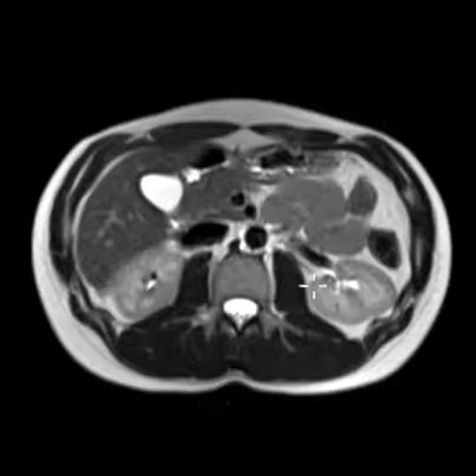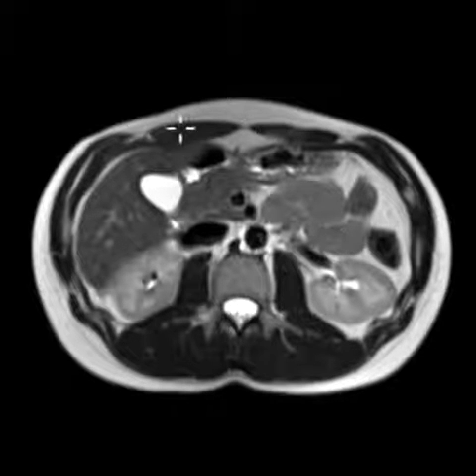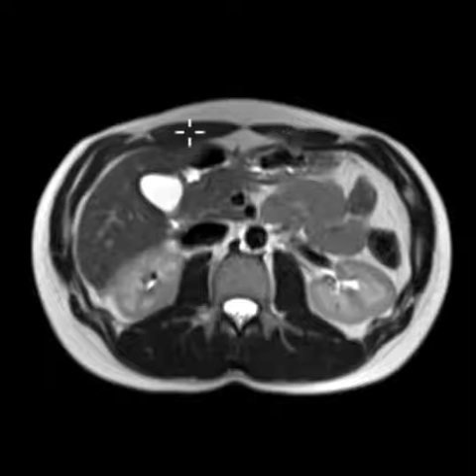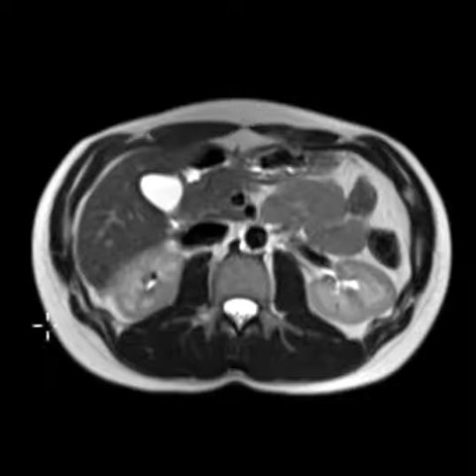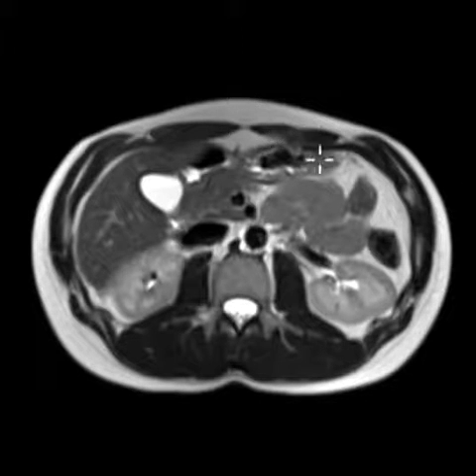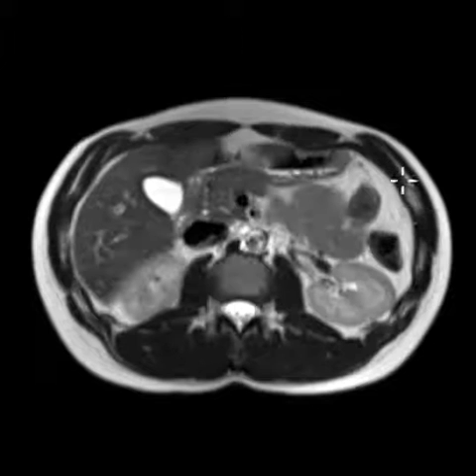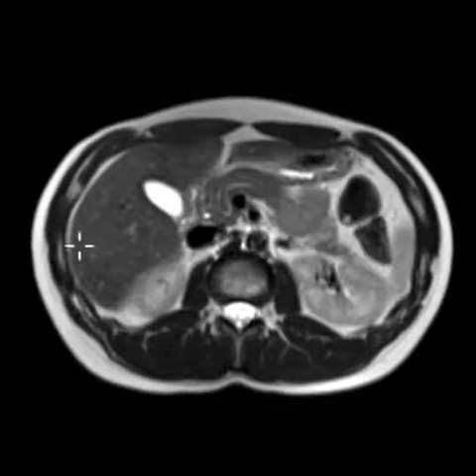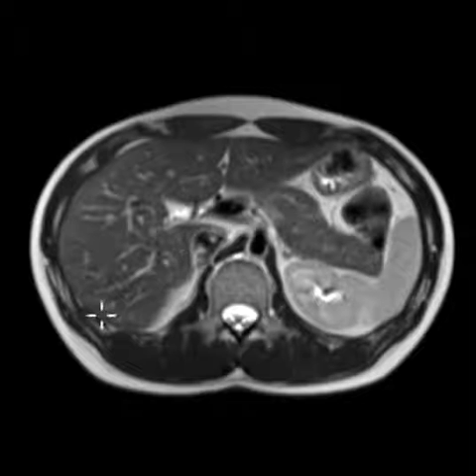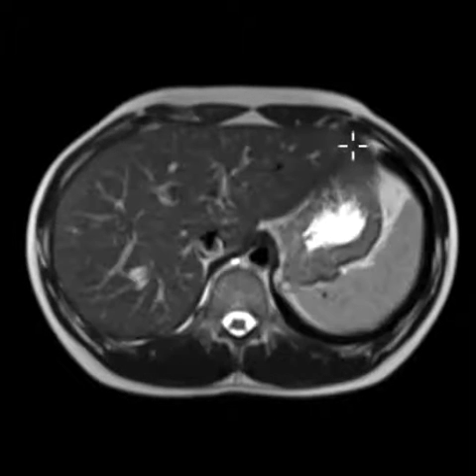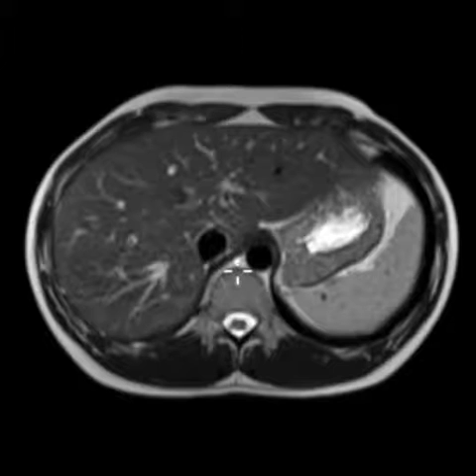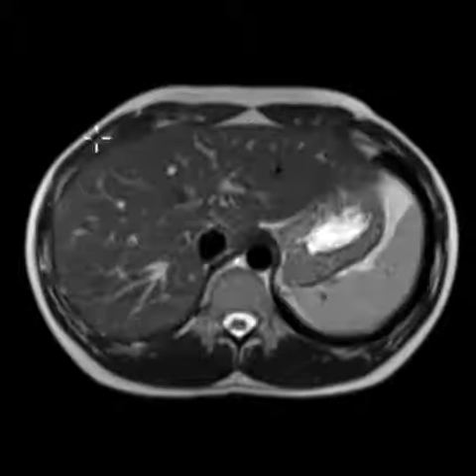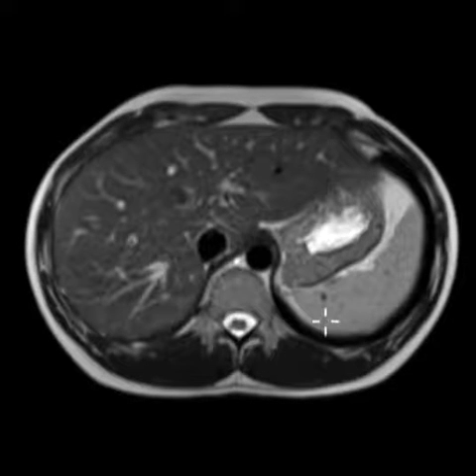This is an MRI image of the upper abdomen. We can see the rectus abdominus muscles — the six-pack — up here. We see subcutaneous fat right around the rim, and you can see some ribs. Over here on the right side of the abdomen we see this gray structure coming around — this is the liver in the right upper quadrant, a big well-defined region of homogeneous signal intensity.